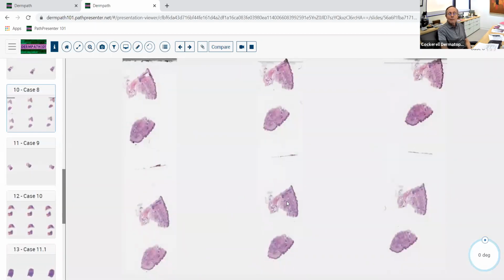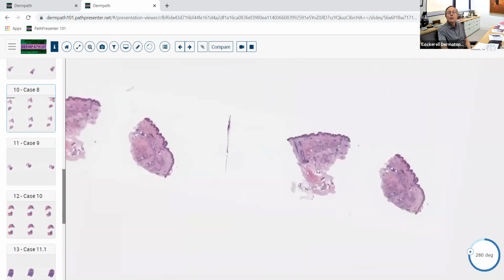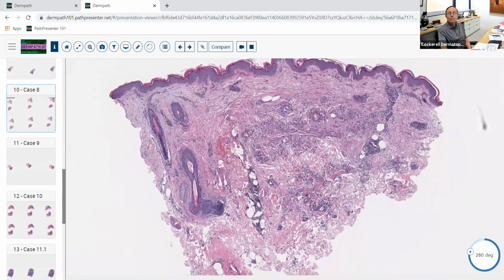Now this, I mentioned this before, I'm glad we have an example of it here, is also kind of going back to the palisaded granulomatous dermatitis. And notice that when we talk about palisade, sometimes the picket fence is really nice and round and it's really well defined. In other cases, there's more of a diffuse pattern where you don't get the nice little rings in the skin. And that's still palisaded granulomatous dermatitis. So when we see interstitial, mostly granulomatous inflammation, that can be seen in GA. We refer to that as kind of forms of sort of like an incomplete, poorly formed palisaded granulomatous dermatitis.